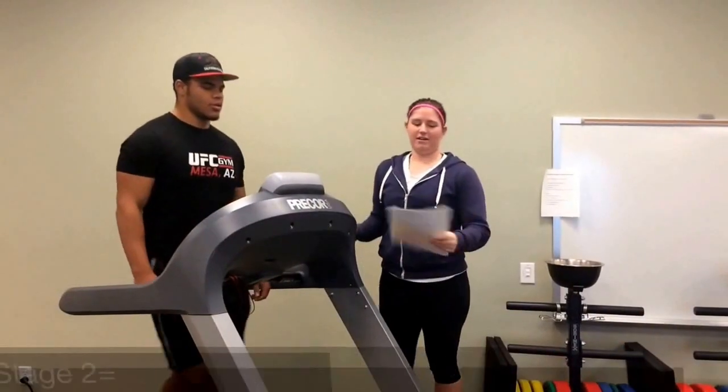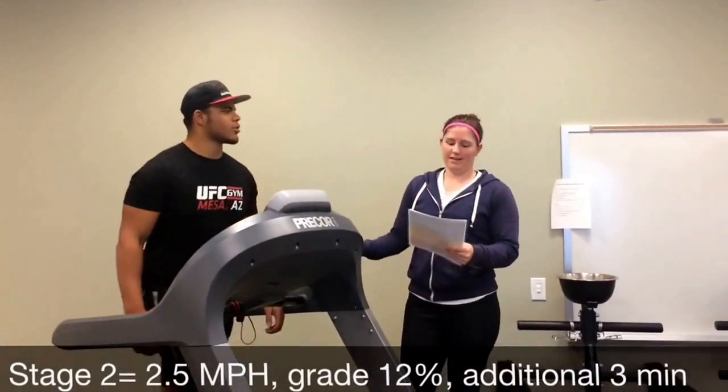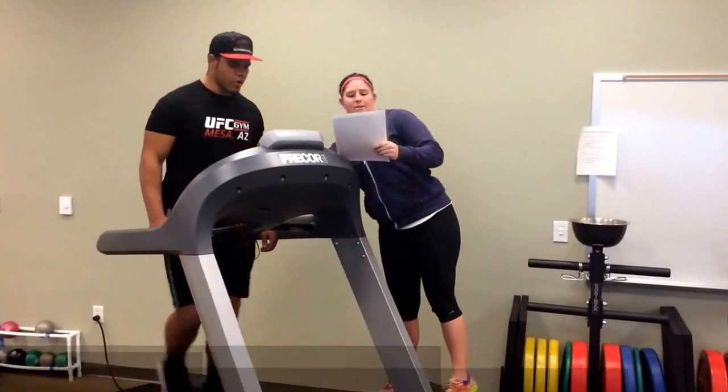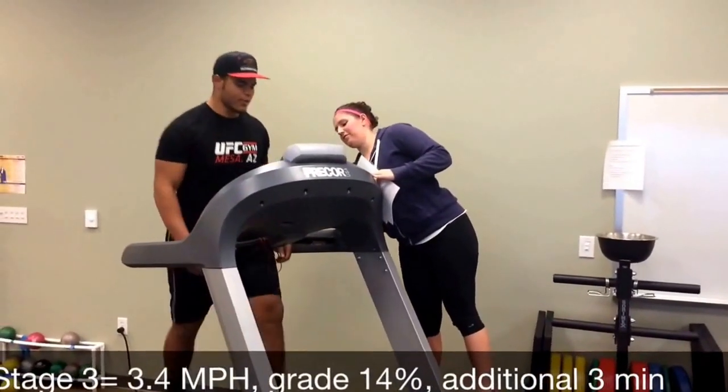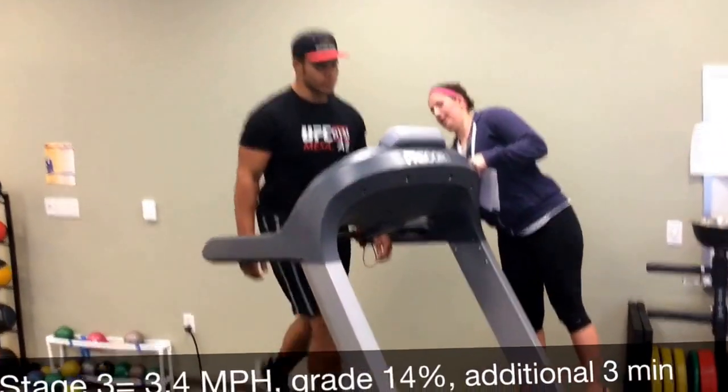Now we are at Stage 2 at a speed of 2.5 miles per hour and an incline of 12 percent. And at Stage 3, we are going up to a speed of 3.4 miles per hour and an incline of 14 percent.